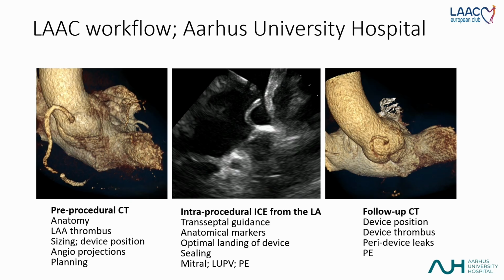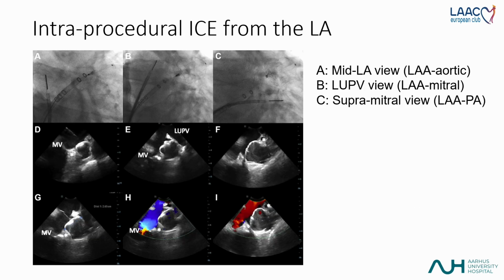We have been involved in Europe in a trial where we are going to implant this device in an ICE-guided workflow. And this is our usual workflow, that we do a pre-procedural CT, typically the day before or on the procedural day. Then we guide the procedure by 2D ICE, and we make follow-up CT scans after 45 days. And we are still left with the standard of a 2D ICE. MDR approval has obstructed our use of a 3D probe until probably, hopefully, within the next few months we will have availability of the 3D ICE probes, but not yet.